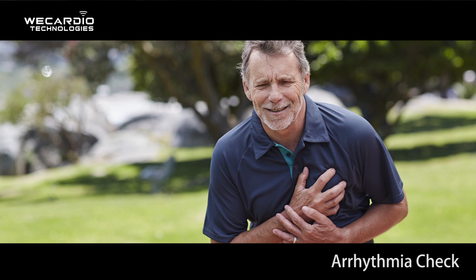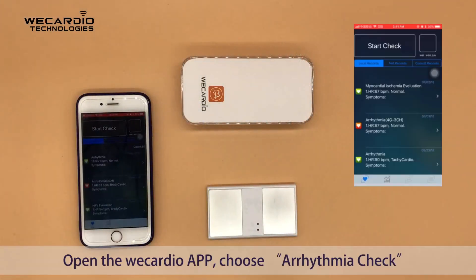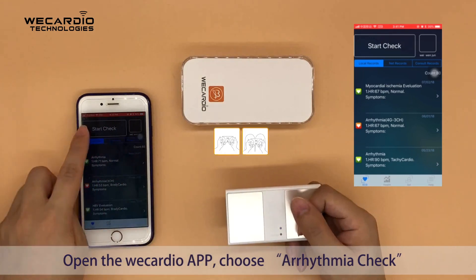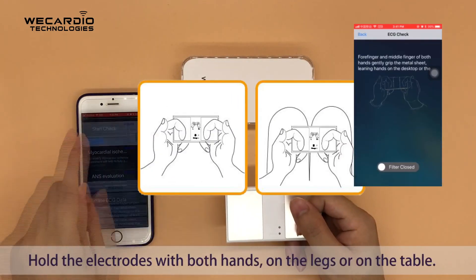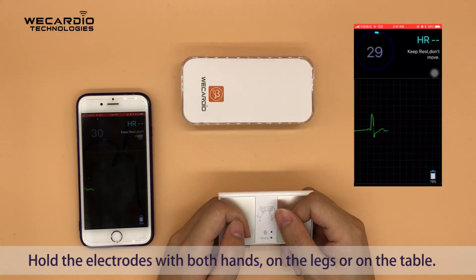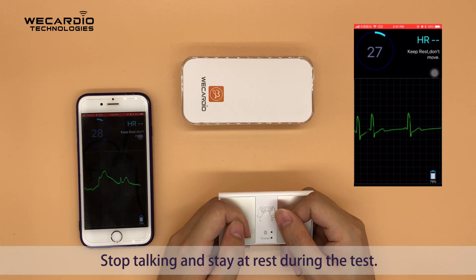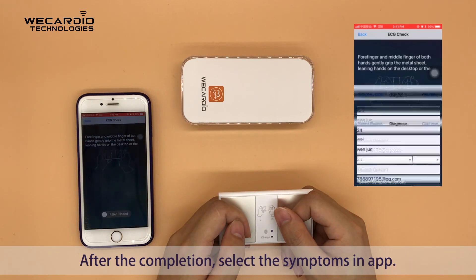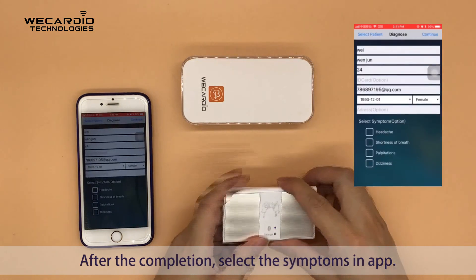Arrhythmia check: Open the WiCardio app and choose arrhythmia check. Hold the electrodes with both hands, resting on the legs or on the table. Stop talking and stay at rest during the test. After completion, select the symptoms in the app.